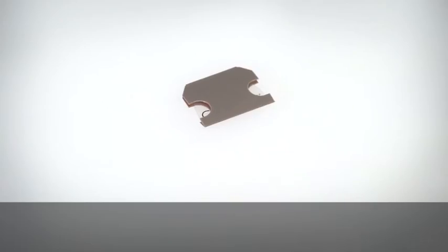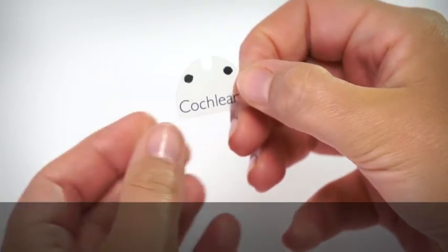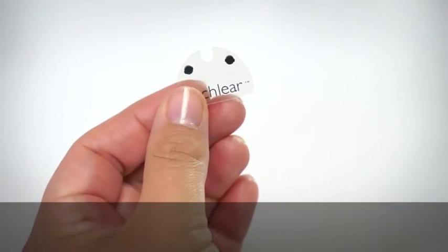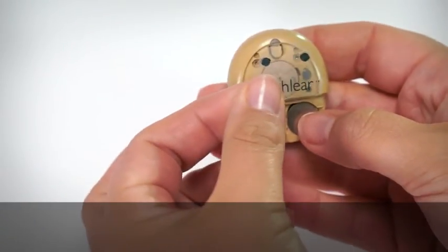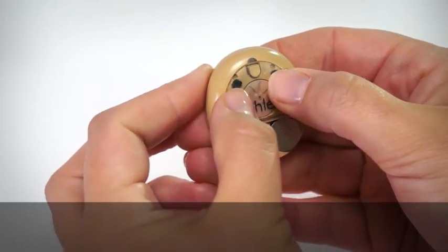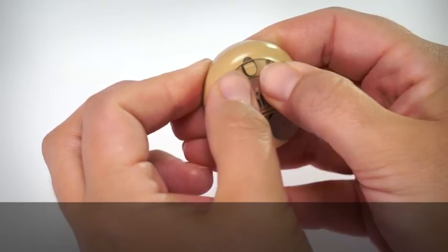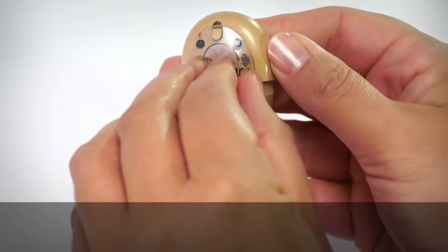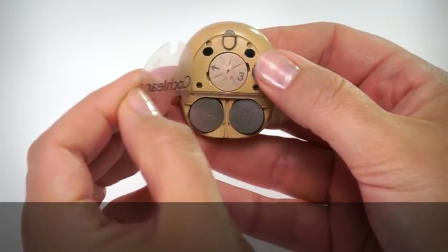To insert new microphone protectors, pull the Kanso microphone protector applicator out of its sleeve. With the microphone protectors facing down, lay the applicator over the processor, aligning the protectors over the microphones. Press the microphone protectors down with your finger. Remove the applicator carefully by peeling it upwards from the side.